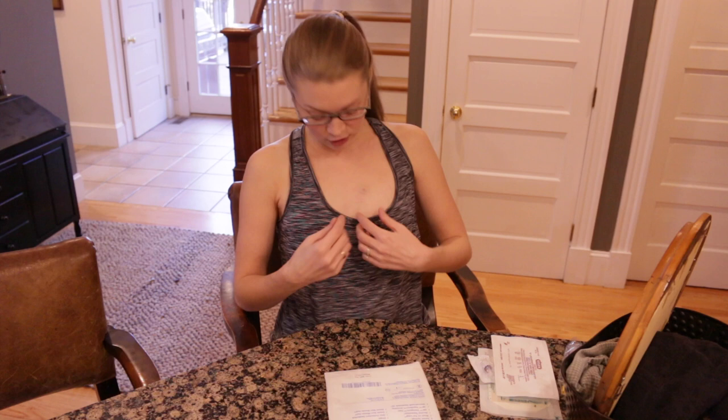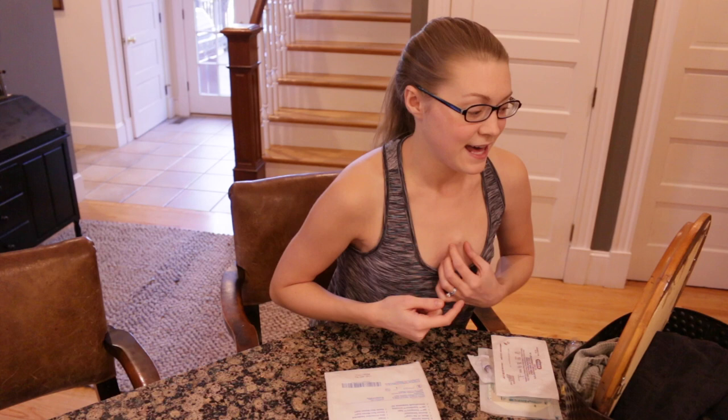You're also going to want to have a mirror close by. Depending on where your port-a-cath is, you might be able to see it well just by looking down. Mine is in kind of an awkward position — when I look down I can't quite see it, so I have to look in a mirror, and I usually have one close by so that I can aim and fire. I've got my 100-unit heparin ready and I've already washed my hands, so we are ready to get started.